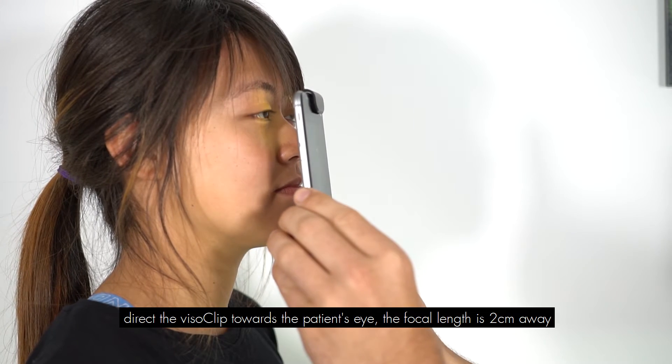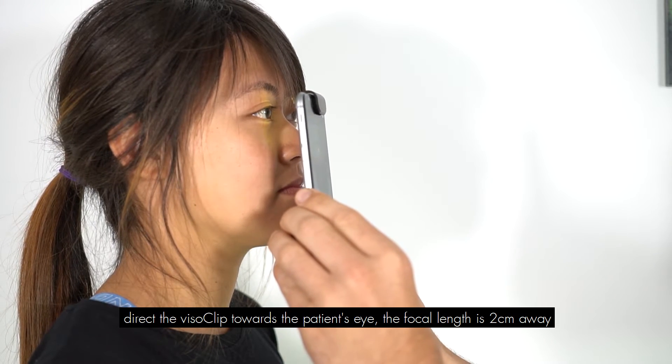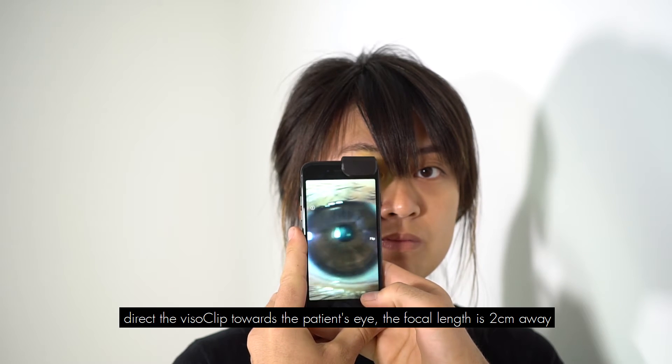Direct the visoClip's lens toward the patient's eye. The focal length is 2cm away.